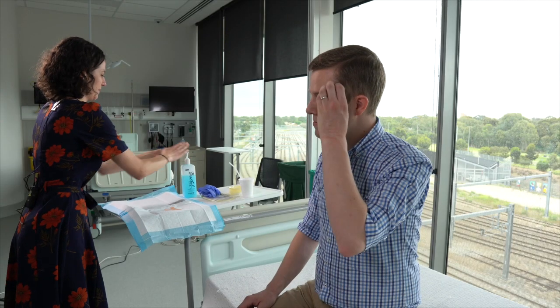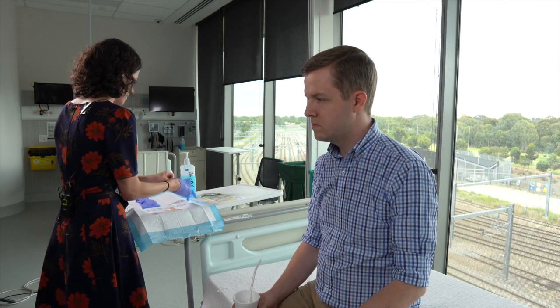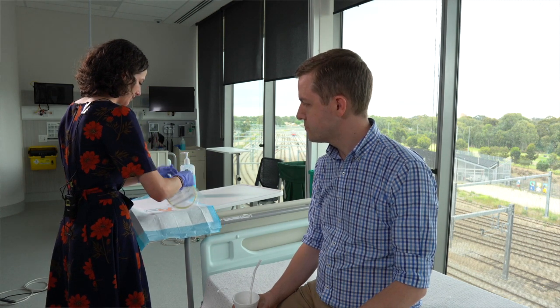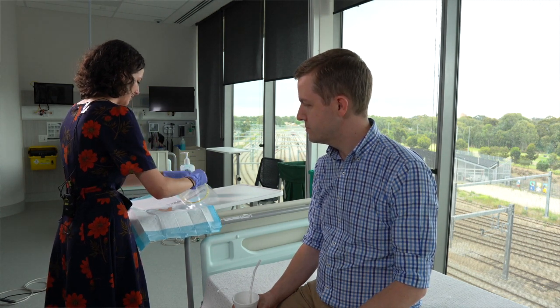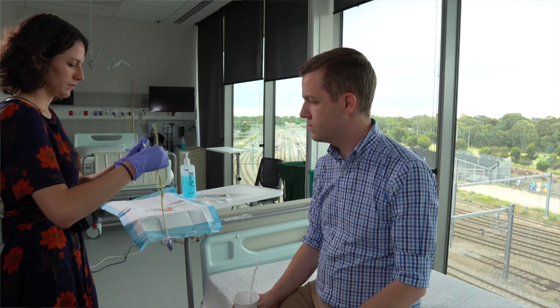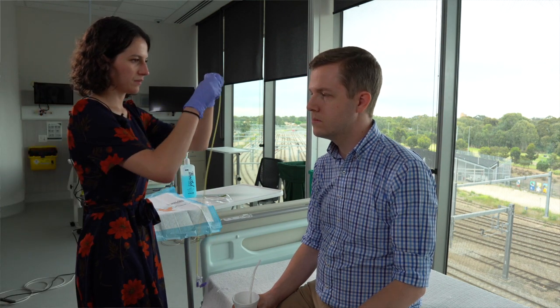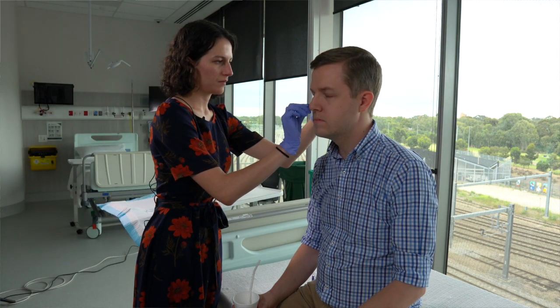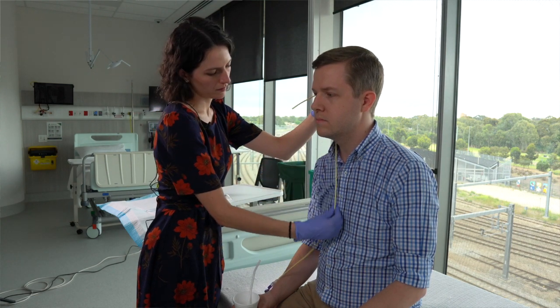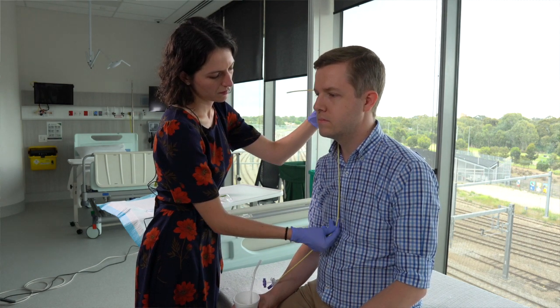The first step is to perform hand hygiene and don the gloves. The patient should be positioned sitting up, ideally at the edge of the bed. The tip of the tube is held against the tip of the nose, then led over the ear and measured down to the level of the xiphisternum at the end of the sternum. This is your target insertion length.